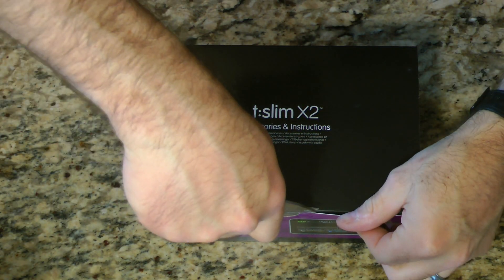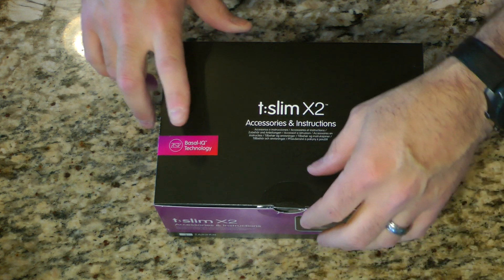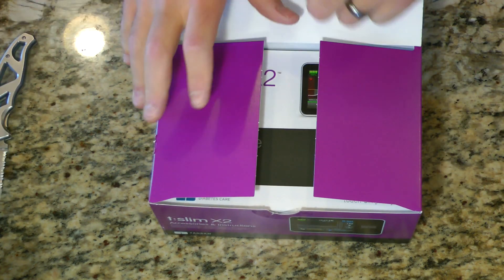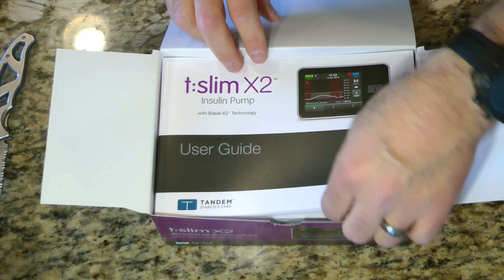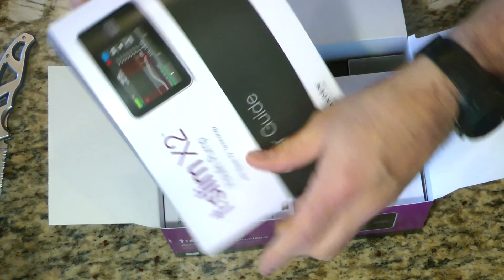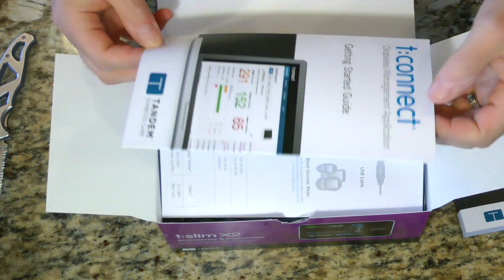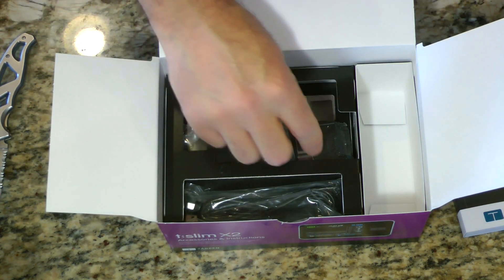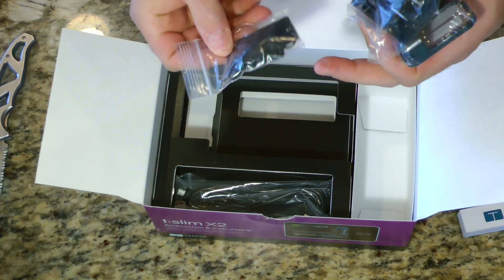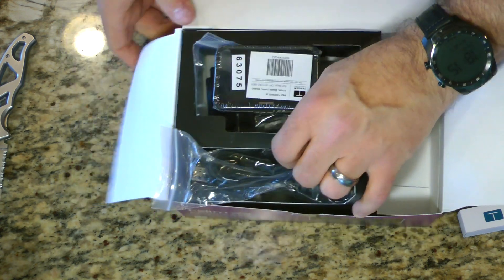Next we've got another box that's quite a bit heavier than the pump box — this is the accessories and instructions. Now this is Basal IQ, which I was told the pump comes with Basal IQ, but I can go ahead and update it to Control IQ right away. So we have the thick user guide — holy cow, who's going to read this? And it's all in English. We've got the T-Connect diabetes management application getting started guide, a belt clip, little case, charger, and USB cable.